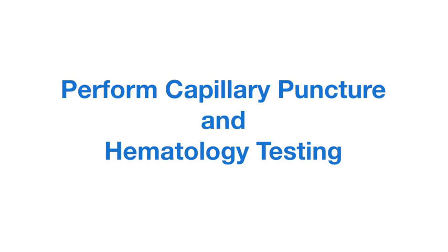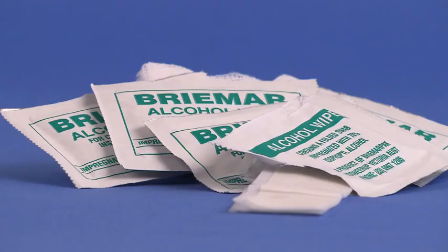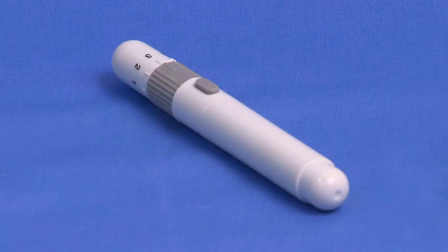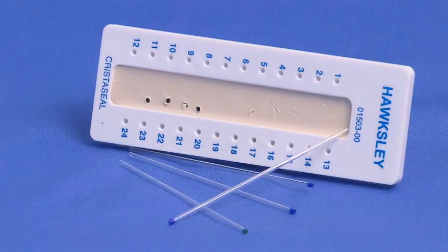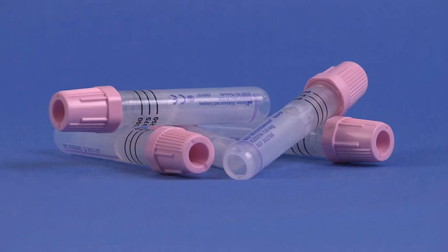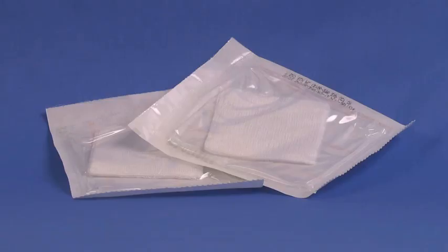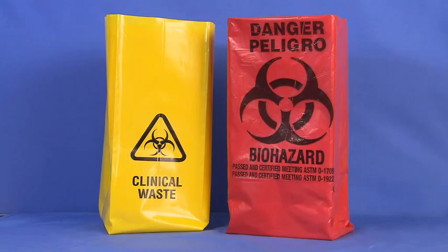Equipment required includes the following: a completed laboratory requisition form, gloves, antiseptic swabs, lancets, an automated lancet device, a biohazard sharps container, capillary tubes and sealing clay, microtainer tubes, collection bags or containers, gauze pads, adhesive tape, and biohazard bags.